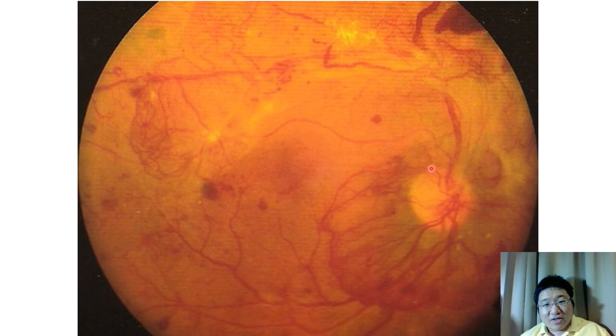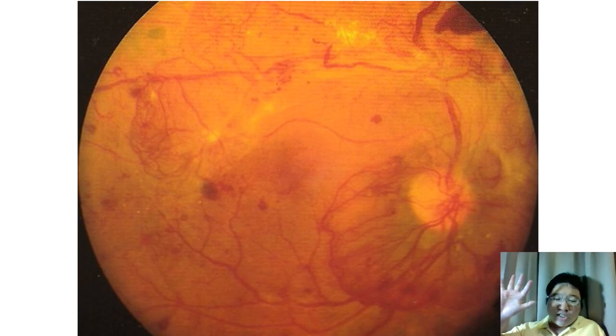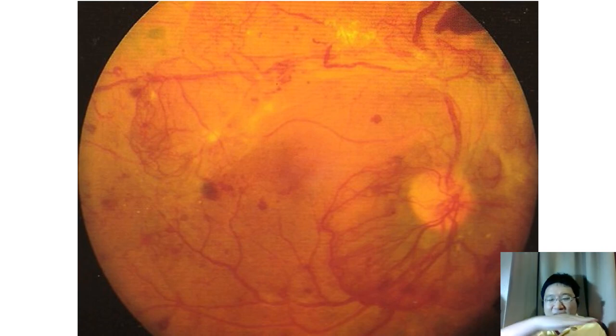And here, what do you see? Okay, the disc looks quite okay, but we see blood vessel proliferation. The blood vessels proliferate a lot with hemorrhage, with many changes in the retina. So this one represents proliferative diabetic retinopathy. Diabetic retinopathy can be divided into two stages, background DR and proliferative DR. The cut point between these two stages is the inner limiting membrane of the retina.